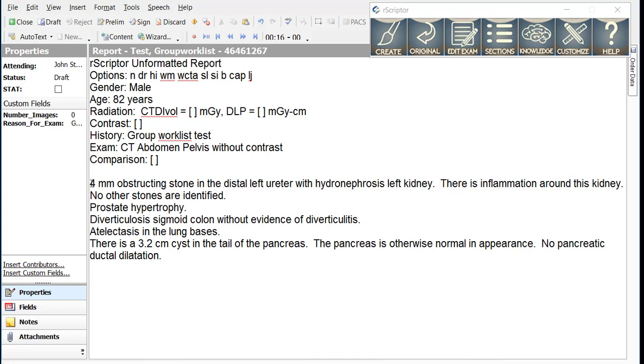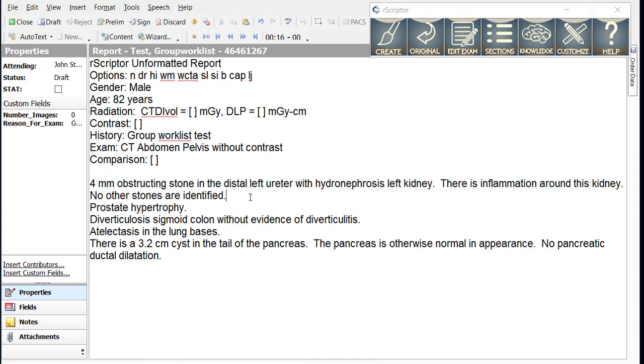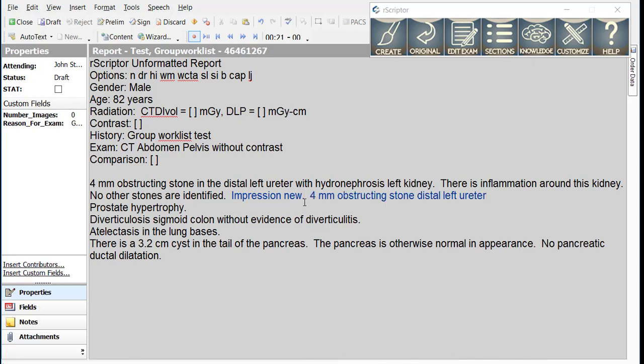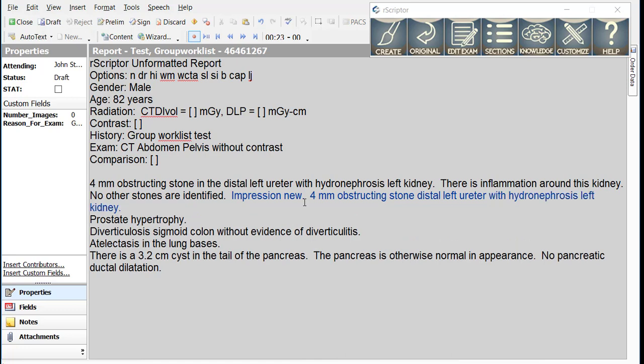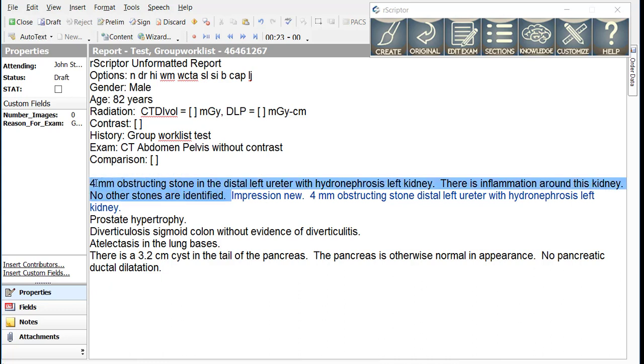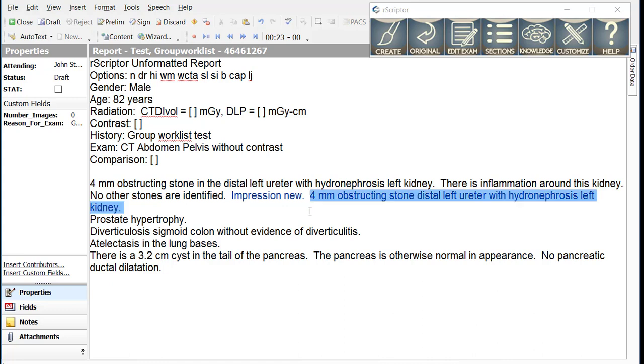In our example here of a 4 mm obstructing stone, we could simply add impression new period, 4 mm obstructing stone distal left ureter with hydronephrosis left kidney period. With this simple statement, we have told R-Scripter that all the text prior to impression new is going to go into the findings section and all the text after impression new will go into the impression section.